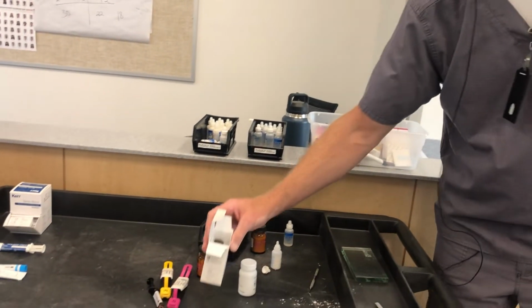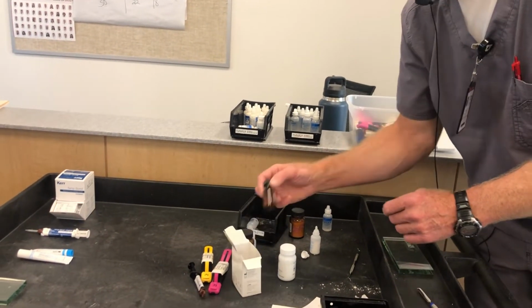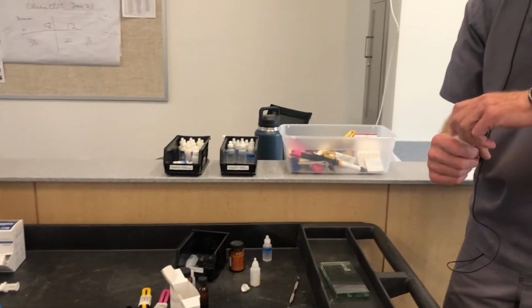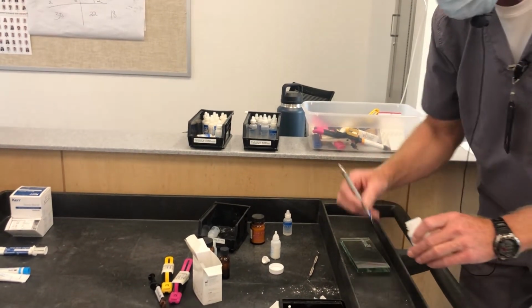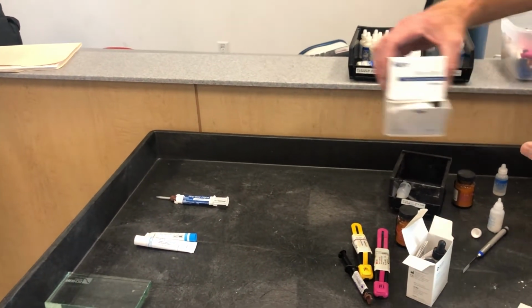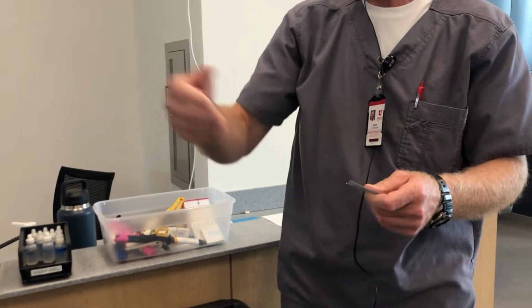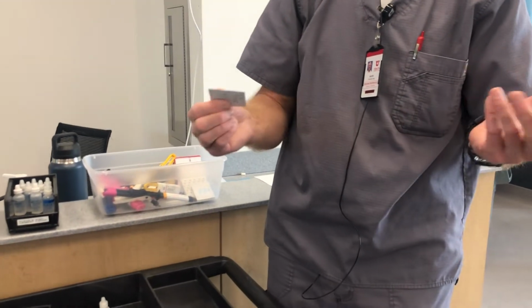IRM is something that when you mix it, and this is a big deal, you want it like dough, like you would get like bread dough. Either a packet like this. This is temp bond. It has eugenol in it. You remember what eugenol does to the tooth? Soothes the pulp. Yeah, it's an obtundant. It kind of calms it down. For that reason, it really is kind of nice.